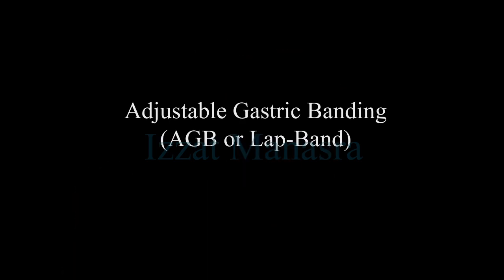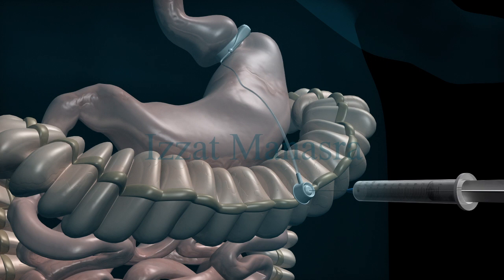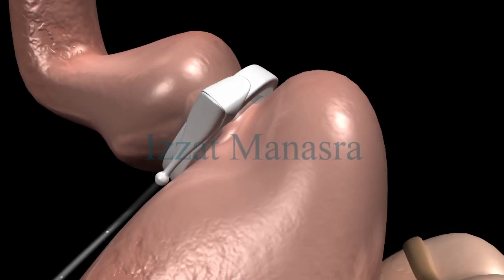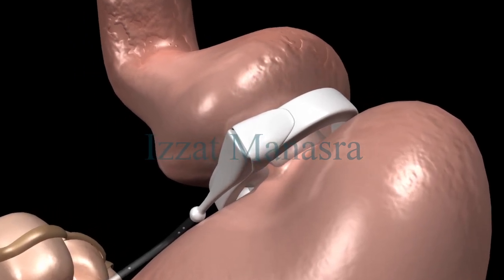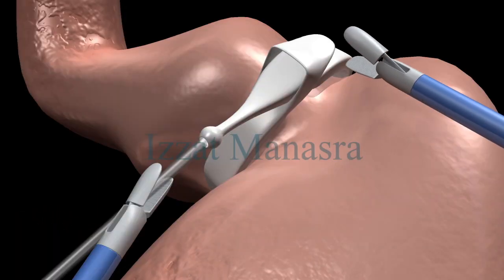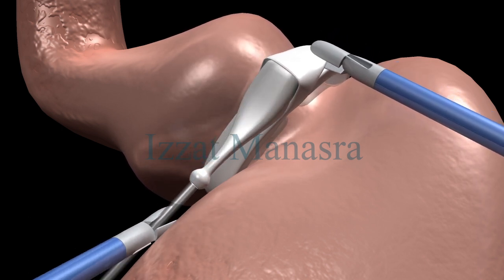tract. During an adjustable gastric banding procedure, also known as AGB or lap band, your surgeon will wrap an inflatable ring around the upper part of the stomach. As the band is inflated, it will squeeze the stomach to create the small upper pouch and a narrow opening into the larger lower portion. This may be done through tiny incisions using a laparoscope. The band may be adjusted at any time.